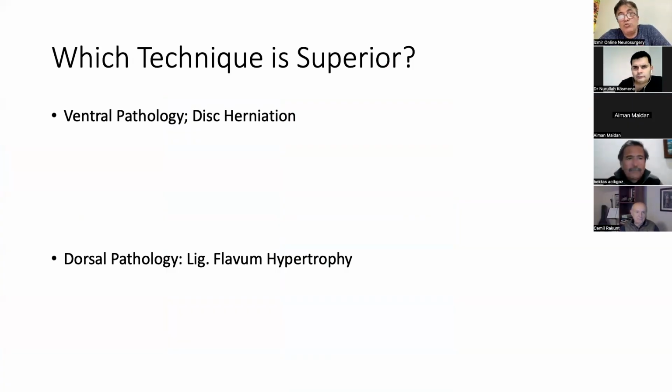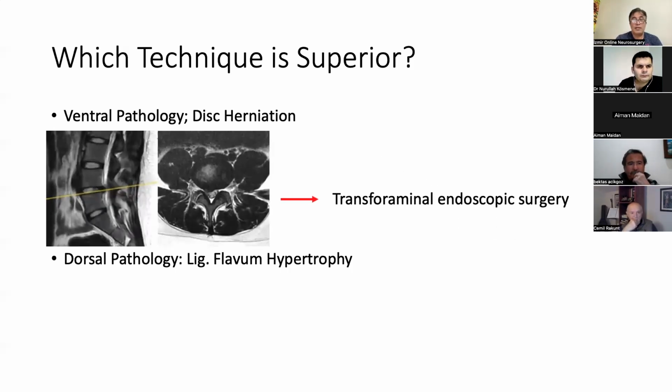Determining which technique is superior in the current technical situation is complex and meaningless. Applying either method for more appropriate cases in actual practice is more important. Uniportal full endoscopic spine surgery enables a keyhole approach and may be effective for ventral and disc surgery.